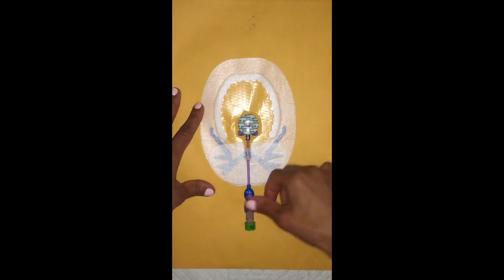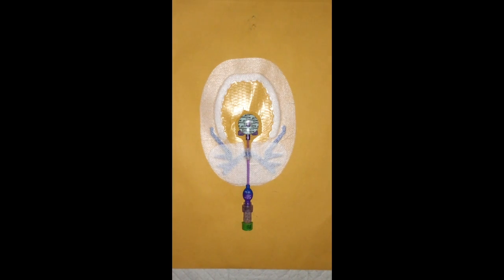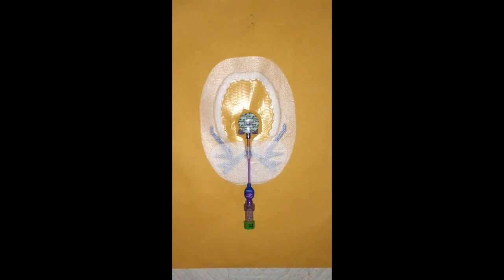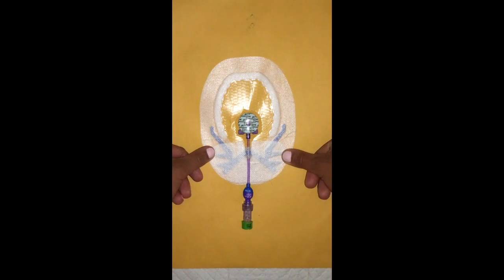Right here we have a single lumen central access, which is the ideal access to have. That's not always the case. So again, these medications can run peripherally if they have to, or you may have a multi-lumen access. In a perfect world, though, it will be a single lumen central access, and because we have control of that today, that is what we're using.